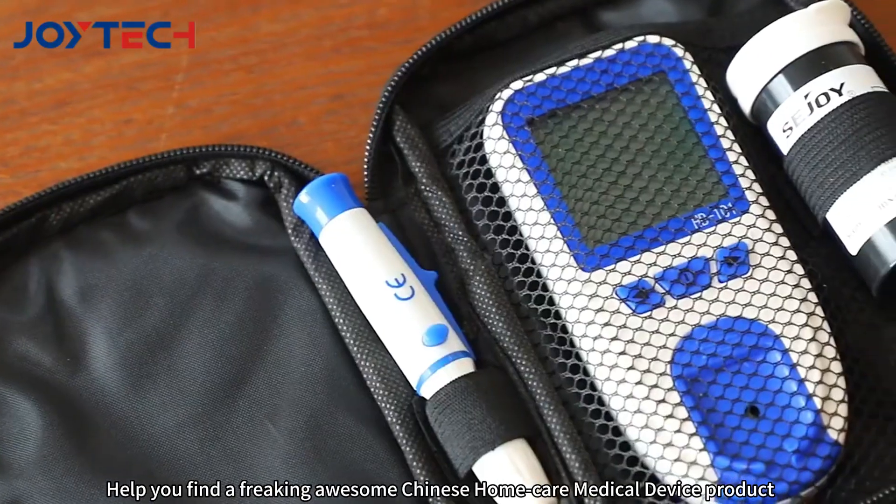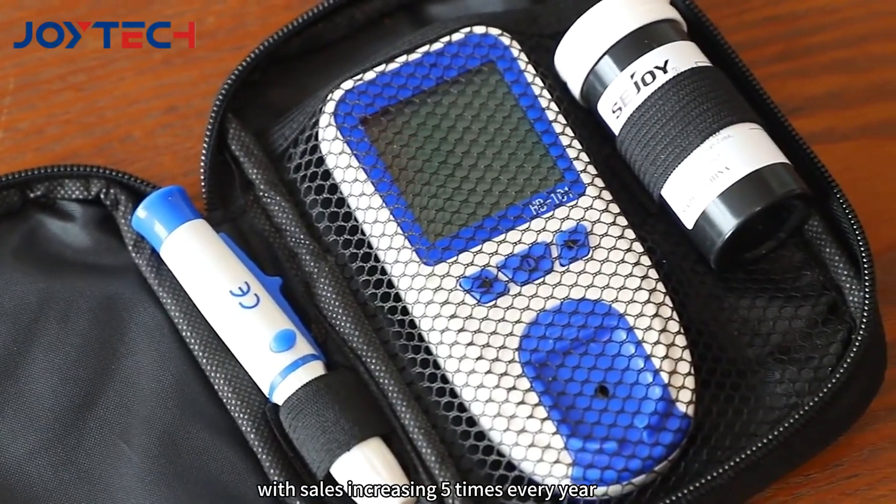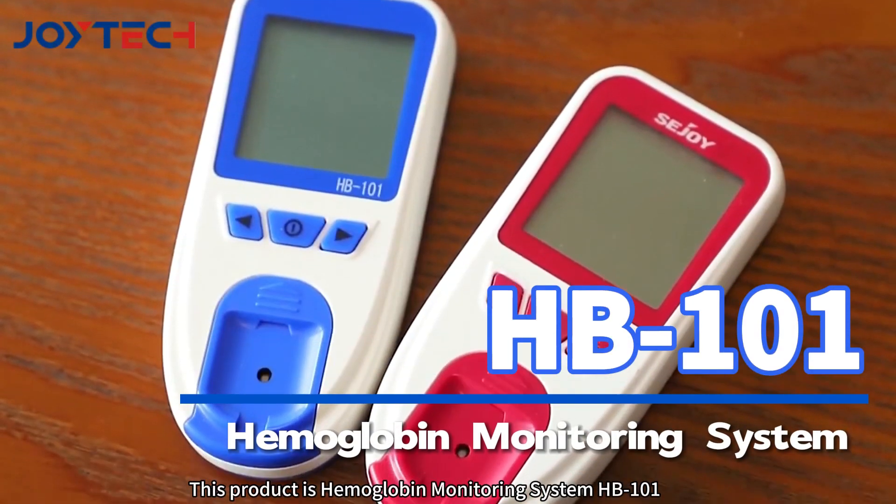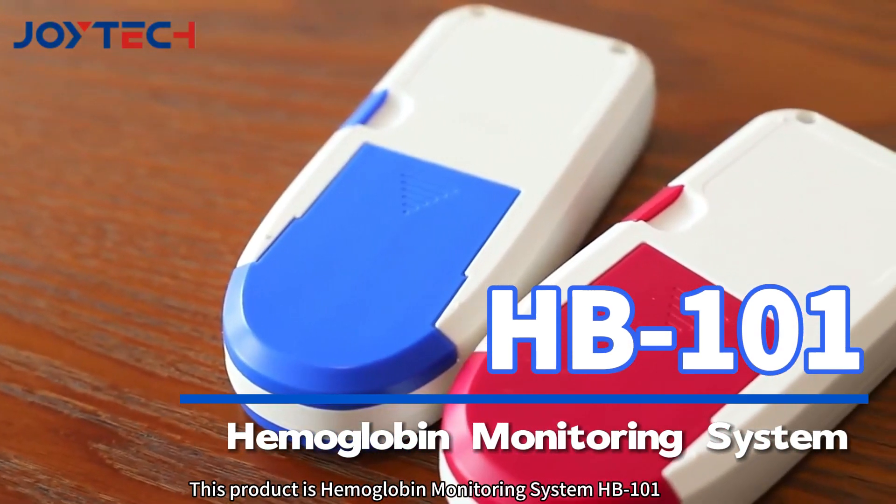This video will help you find a freaking awesome Chinese home care medical device product with sales increasing five times every year. This product is the Haemoglobin Monitoring System HB-101.